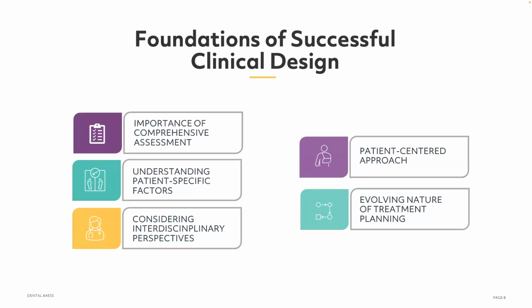Then we need to do the treatment plan based on what the patient needs. So, a patient-centered approach, working and providing a treatment plan that adjusts to the patient's needs. And also understand the evolving nature of treatment planning, the fact that the treatment plan can change during the process, because it can happen that sometimes the teeth don't move as we expect.